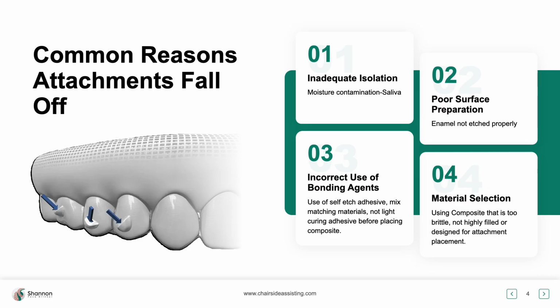The other thing is underutilizing or maybe misusing proper bonding agents. When we think about adhesives, you really don't want to use a self-etching adhesive. You can use a universal adhesive, and that's what we're going to be utilizing today. And we don't ever want to mix and match materials. One of the things about this box and partnering with the manufacturers that we partner with is we never ever mix materials. This is where we see failure.